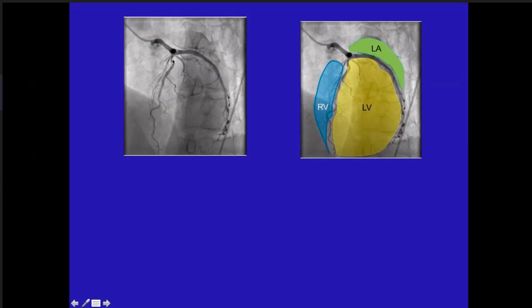But when you do cranial view, sorry, I didn't get it. You said something? Okay. So, no, sir. What elongates the proximal part of the coronary artery will shorten the distal part of the coronary artery. It may do it differently. Therefore, you have to do, again, other view for the distal coronary artery. I keep repeating that again and again because that's the principle of angiography.